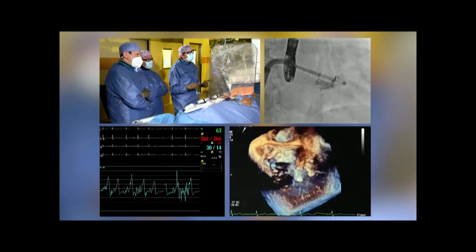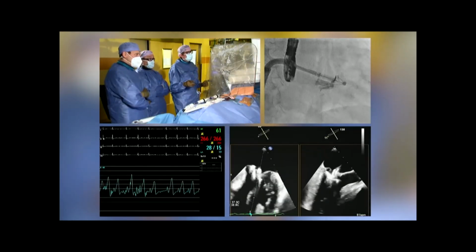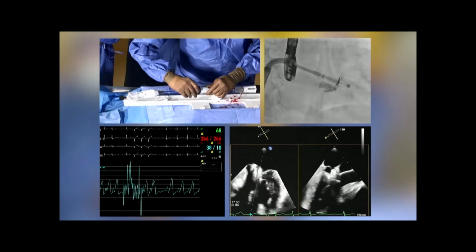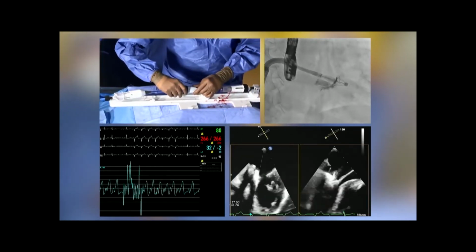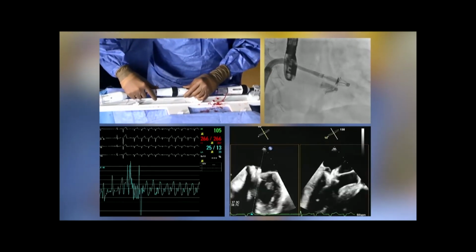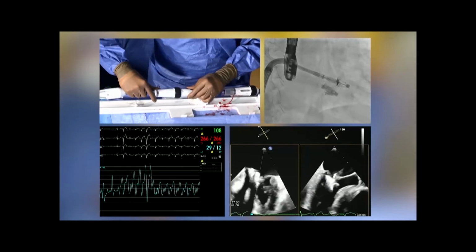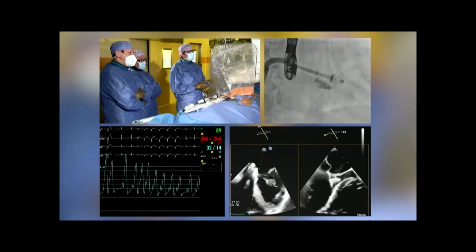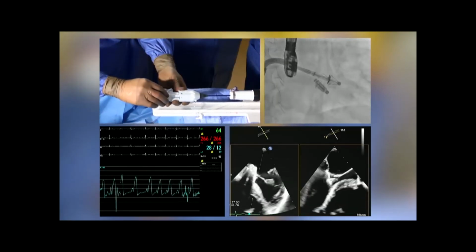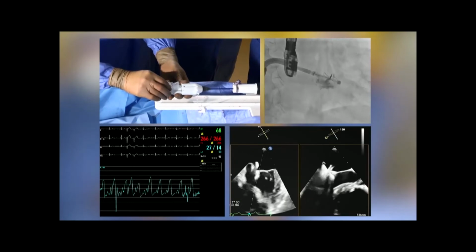Okay, orientation is fine, but not close enough, not close enough. The question is if the cords will keep us away from the first device now, so that you have difficulties to swing close enough over to the first device. Okay, anterior is a lot of tissue in. Let's bring anterior down, please, and then double check on 3D for the clocking.